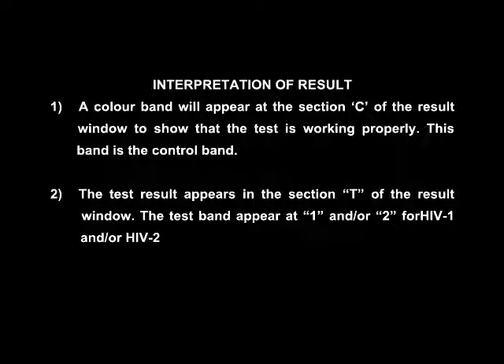A colour band will appear at section C of the results window to show that the test device is working properly. This band is the control band. The test result appears in section T of the results window. The test band appears at 1 and/or 2 for HIV 1 and/or HIV 2.